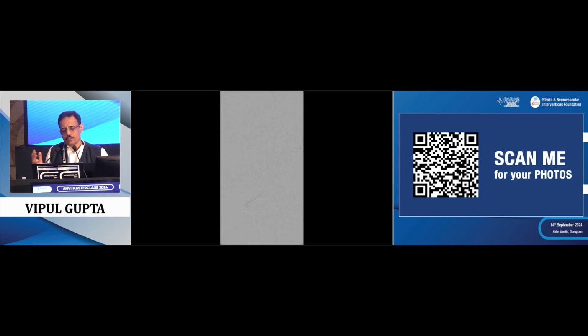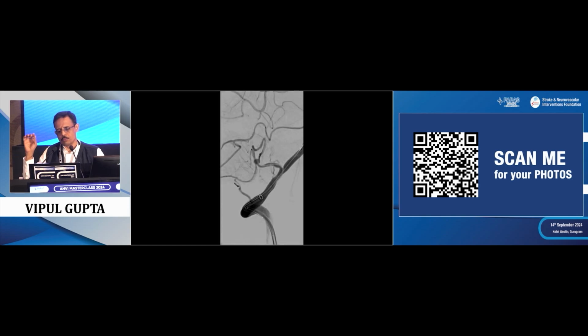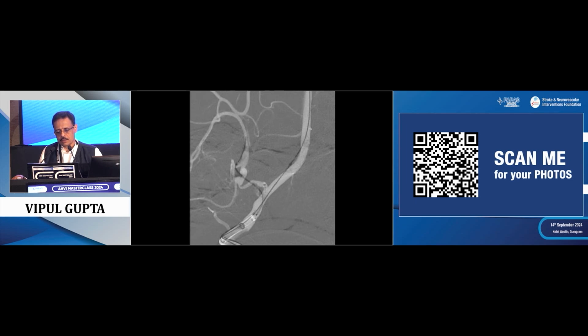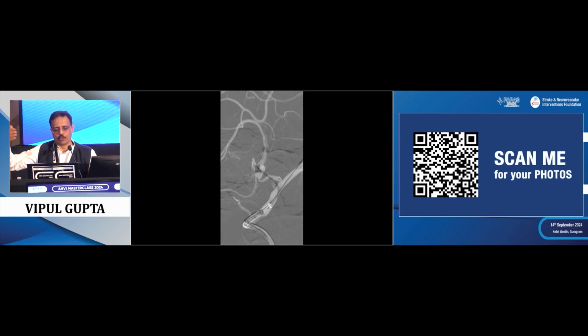Now, also when you're doing FD in such a case, you want to worry about the distal, and you see the whole artery position will change once you place the microcatheter. That's a Vista Baby. The whole artery straightened off, but we know it will reform when you deploy the flow diverter. It reforms into its original configuration.